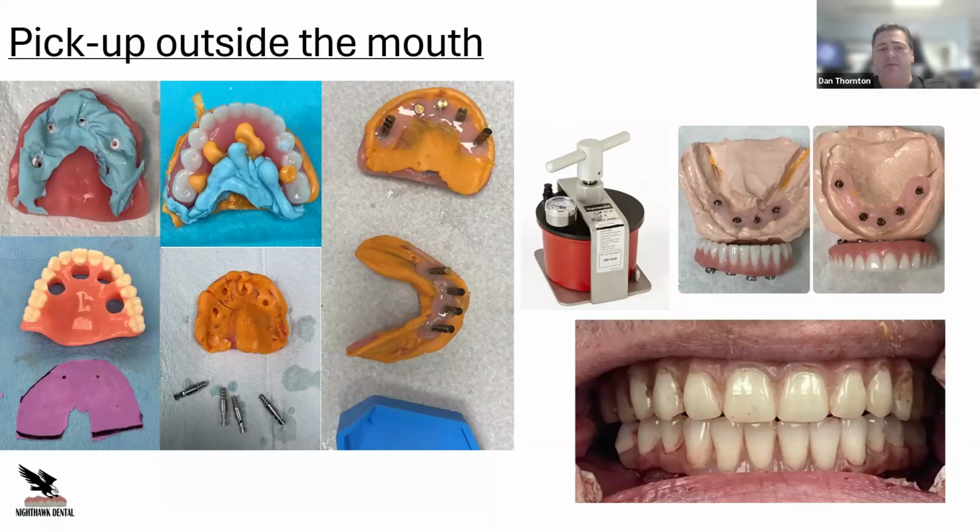And I found out a lot of times with the rubber dam, it's easier to kind of stretch it over and then poke holes where your cylinder's at, just so it's nice and tight on that cylinder. And that way it drapes over top of the ledge of that cylinder too. And it just kind of holds everything down and out of our way while we're trying to do the pickup.